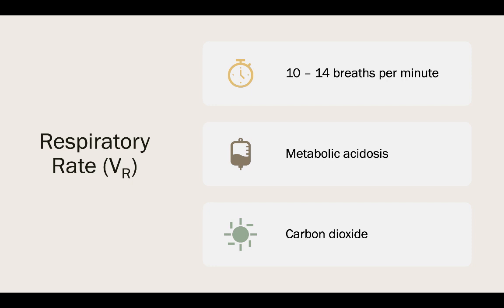And here, we put down metabolic acidosis, so there are instances where we won't be doing 10 to 14 breaths per minute. We've got that DKA patient. That patient's breathing at 30 times a minute to compensate for that metabolic acidosis. Well, we want to keep that going, right? So if we're going to RSI and vent our DKA patient, we're going to be setting that a little bit higher than that 10 to 14. But this is for your normal patient.